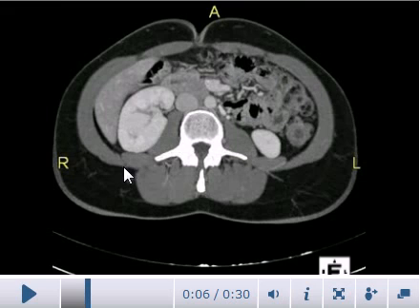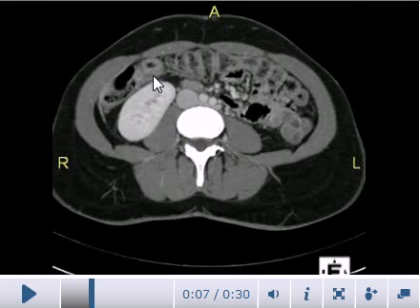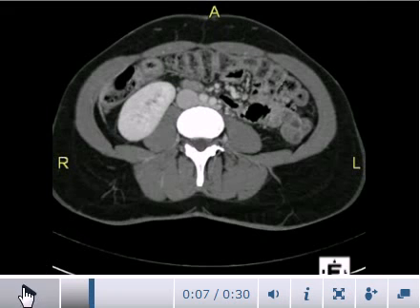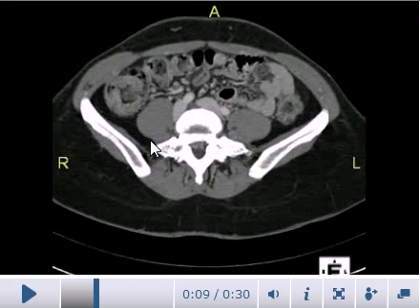The transverse colon is visible here, along with the right kidney. The transverse colon is clearly visible with air in it. The aorta has divided into two branches. These are the psoas muscles, and this is fat below the skin. Pelvic bones are also now visible.